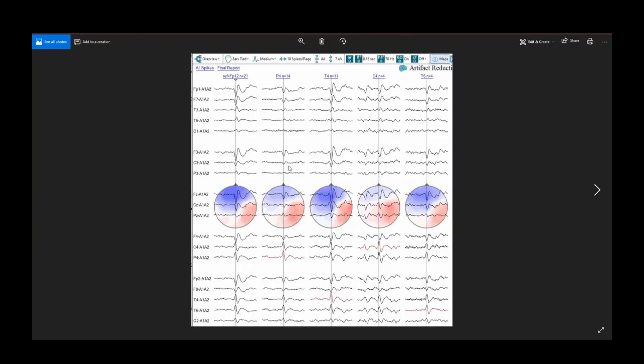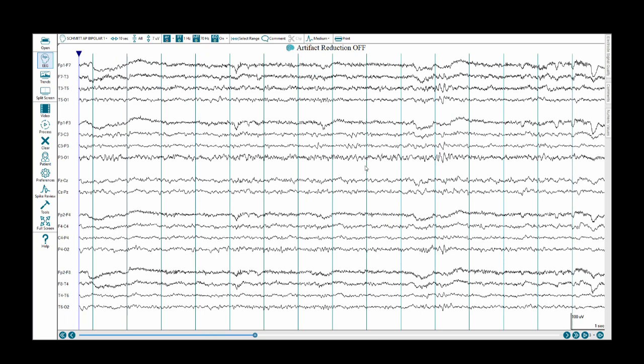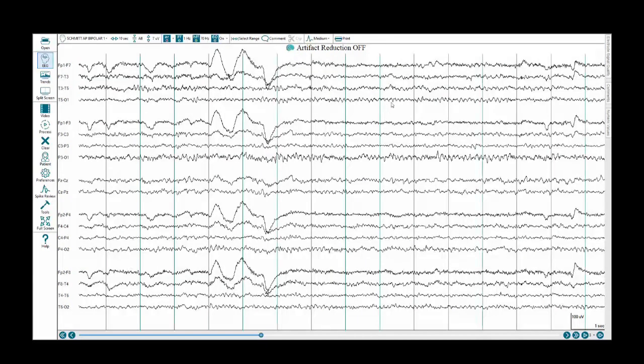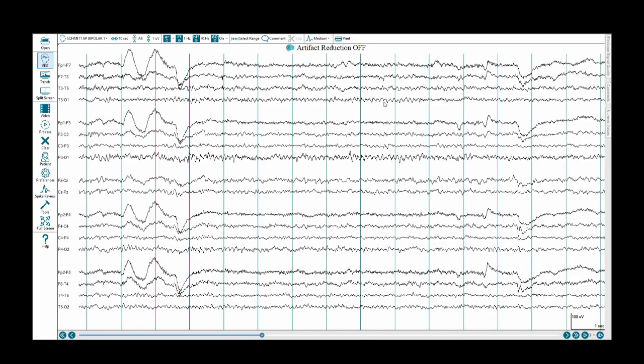We're going to finish up today by just reviewing the rest of this record. See a nice PDR, 1, 2, 3, 4, 5, 6, 7, 8, 9 Hertz at times.